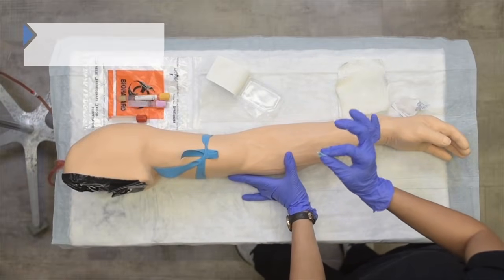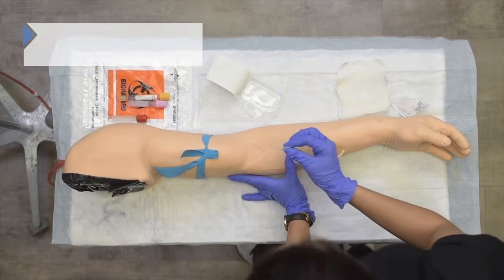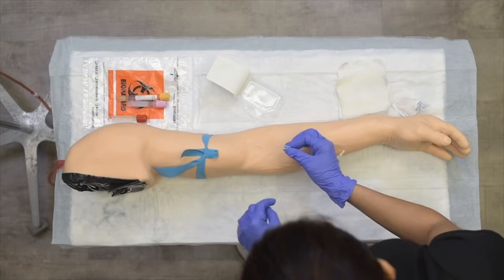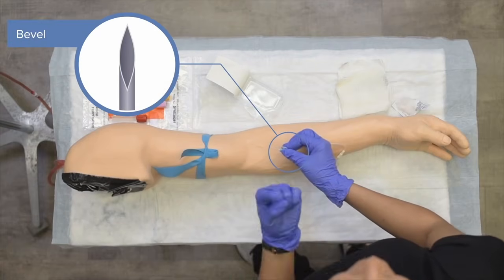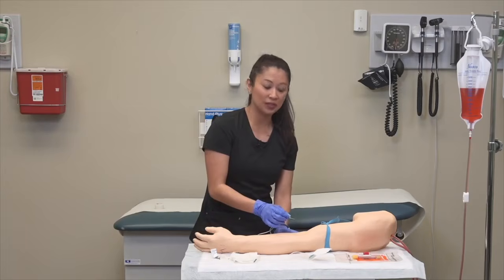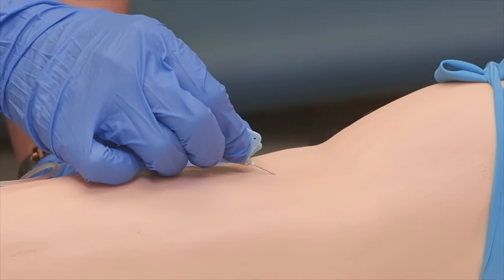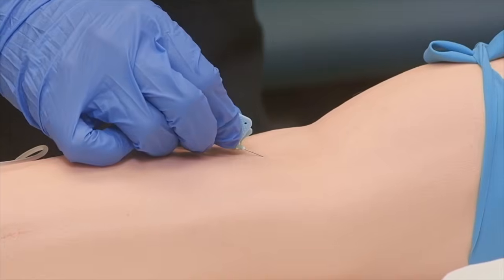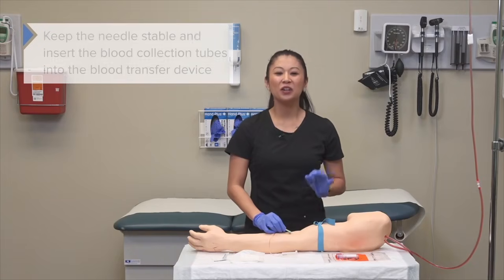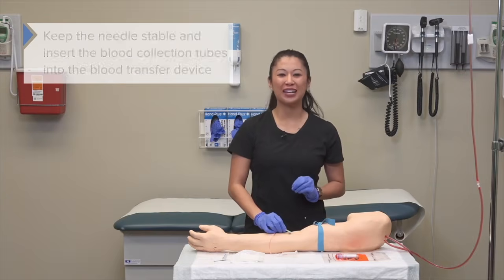Now with my dominant hand, as you see here, I'm going to make sure I insert the needle with the bevel up. If you remember when you're talking about the bevel, if you look down at the needle, you should see the eyelet or the hole of the needle looking up at you. So now that I've done this, with the bevel up, I'm going to access the vein. Now once we've been successful in accessing the vein, do your best here to keep the needle as stable as possible with your dominant hand.